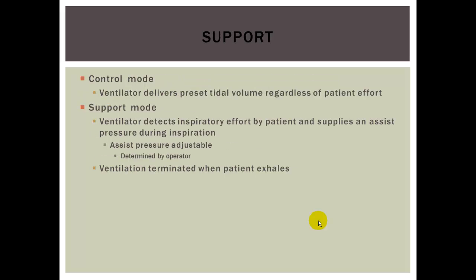Support is also a term. This is going to be on ventilator modes, and this would be if we wanted to change the type of ventilatory support that we're giving our patient. We have a control mode: the ventilator delivers a preset tidal volume regardless of the patient's effort, and this is going to be absolute control of the patient's ventilations. And then we have support mode: the ventilator detects inspiratory effort by the patient and supplies an assisting pressure during inspiration.